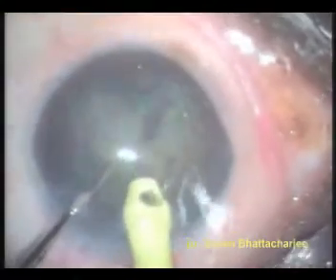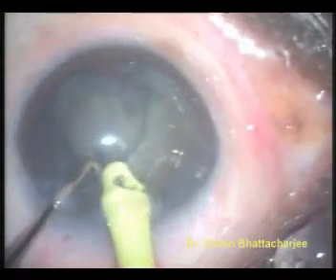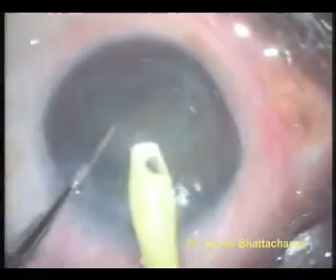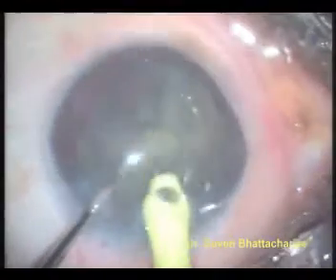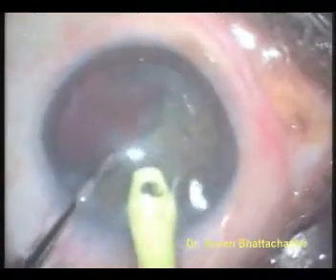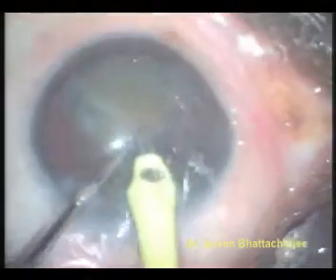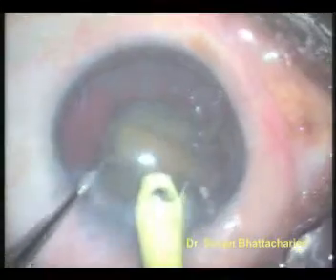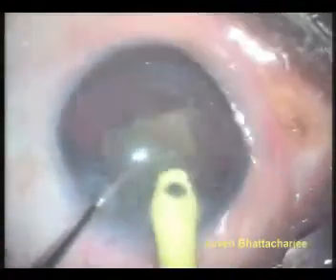The amount of fluid coming into the eye, or the infusion, the amount of ultrasonic energy used, and the amount of fluid going out of the eye by means of vacuum or suction needs to be precariously balanced throughout this procedure so that the inner layer of the cornea, or the endothelium, is not damaged by frequent collapses of the anterior chamber.